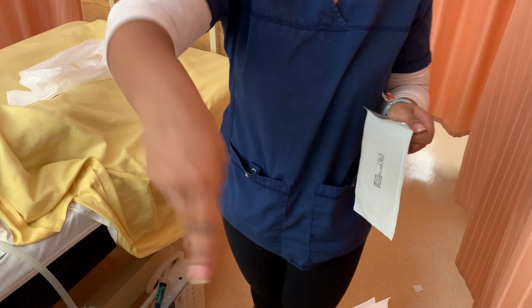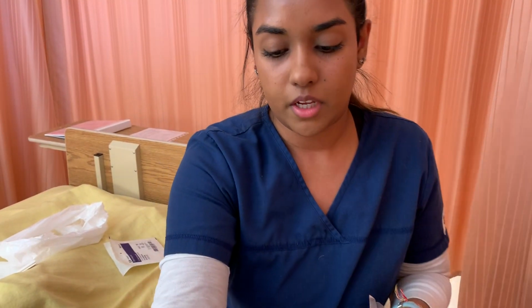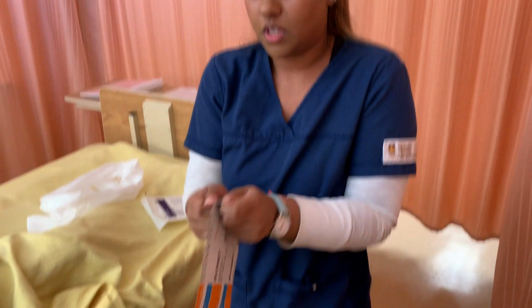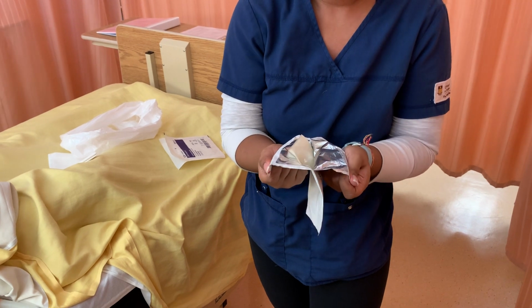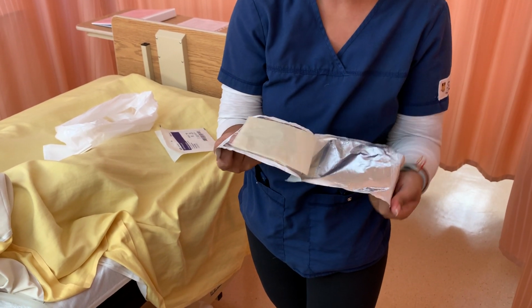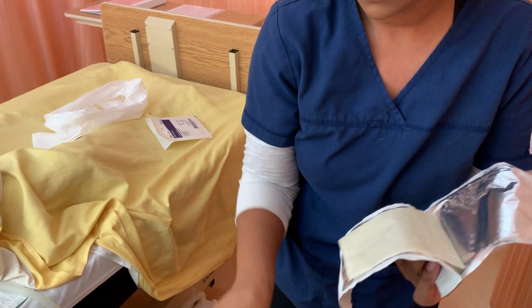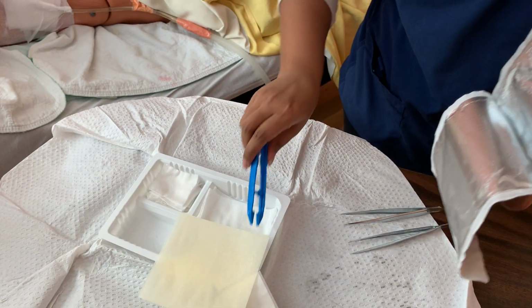I think I might have crossed over my sterile border there when I went to put my normal saline away, so I would just get a new kit and restart. I'm gonna open my Gelinette. And just pop that right there.